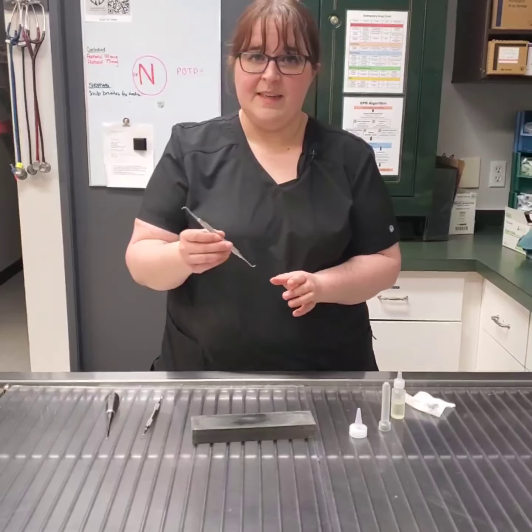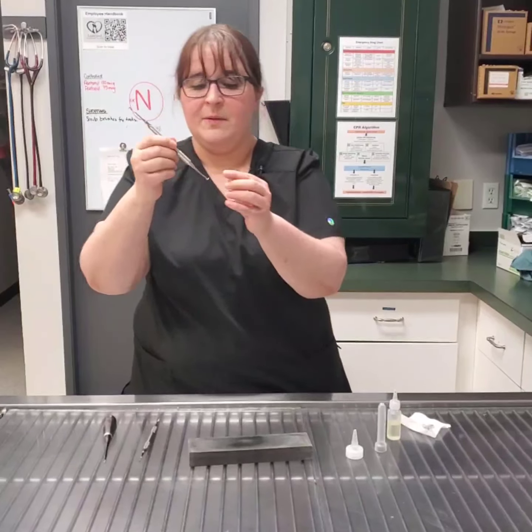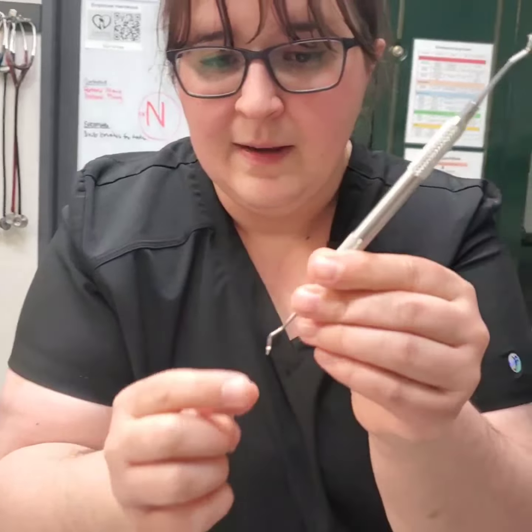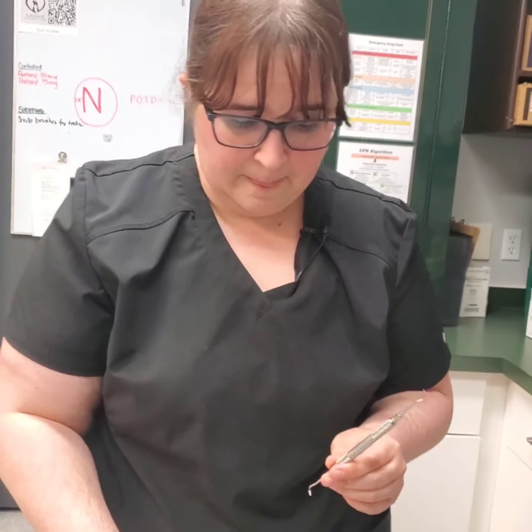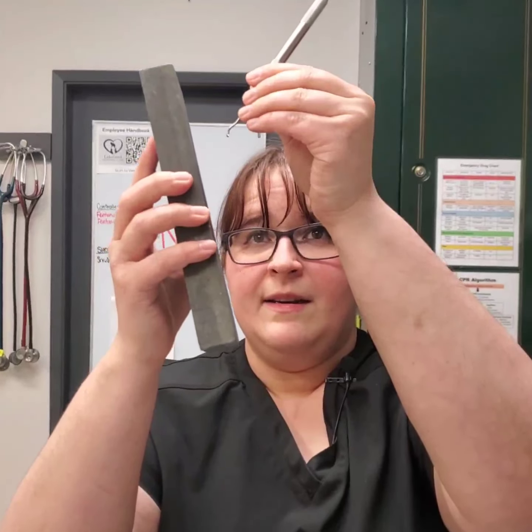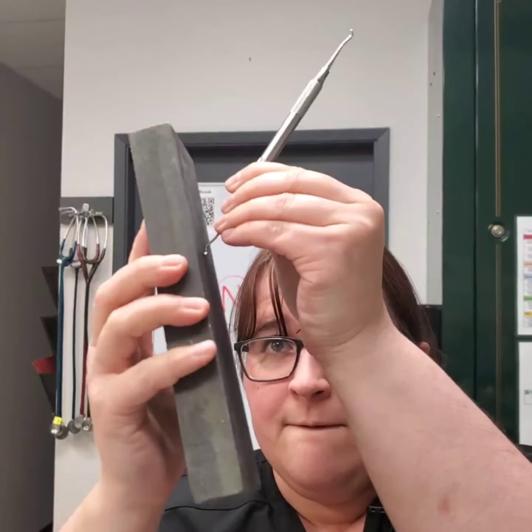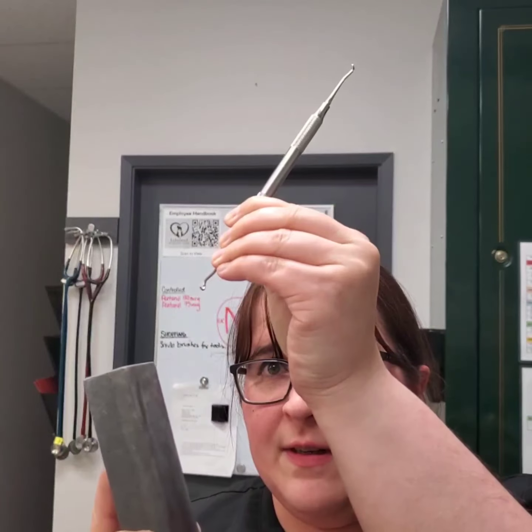And I'm going to take my scaler, and I'm going to use the clock that is behind the camera, and I'm going to line up the distal shank. So this part here, I'm going to make sure that that's vertical, and I'm going to be angling using the 1 and the 11 on the clock behind the camera. So I'm going to take this, and I'm going to hold that up, and I am going to go at the 1, and I want to make sure that I am ending on the downstroke, so down like that.